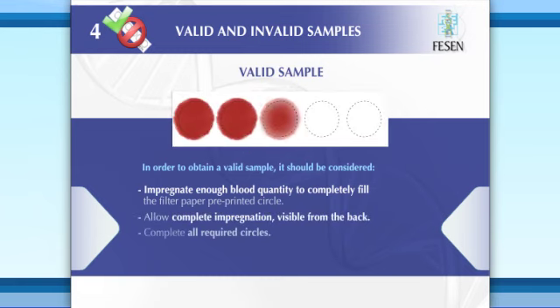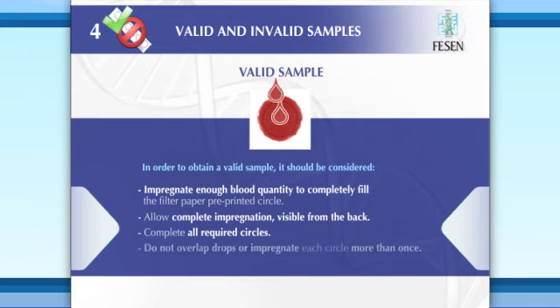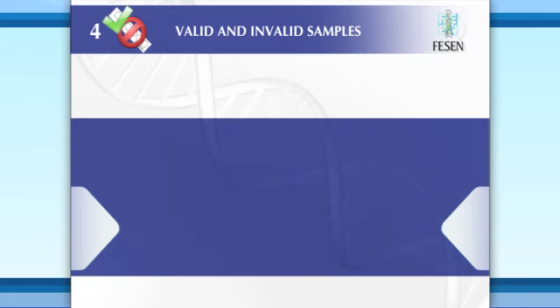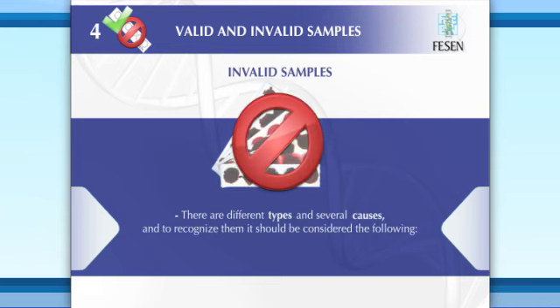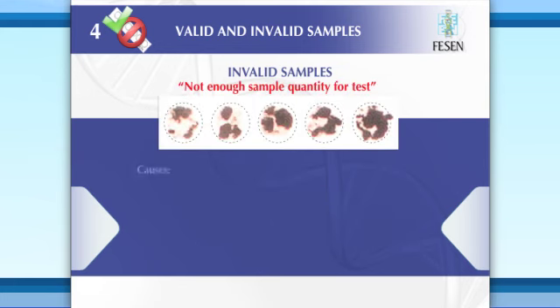Complete all required circles. Do not overlap drops or impregnate each circle more than once. Do not touch samples. Invalid samples could also exist. There are different types and several causes, and to recognize them, it should be considered the following: not enough sample quantity for test.